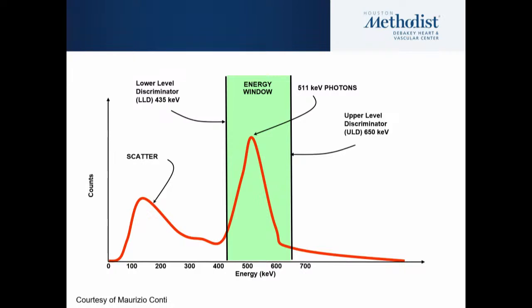So when you image, that's a concept like you do in SPECT also. You tell the electronics and computer to look only within a certain image energy window. Again, one of the tested points is that it's usually about 10% on each side of the spectrum.